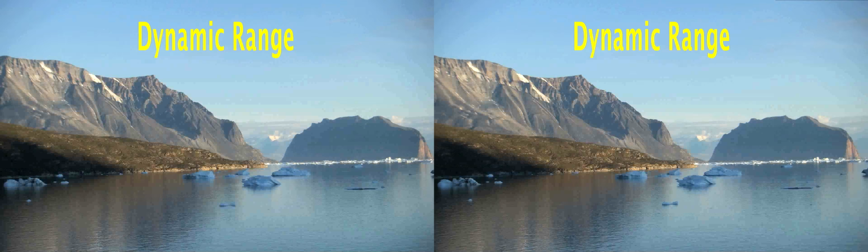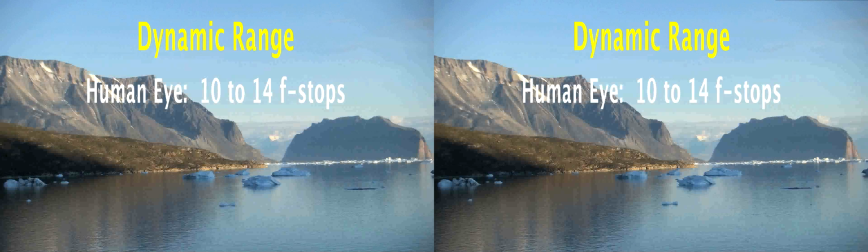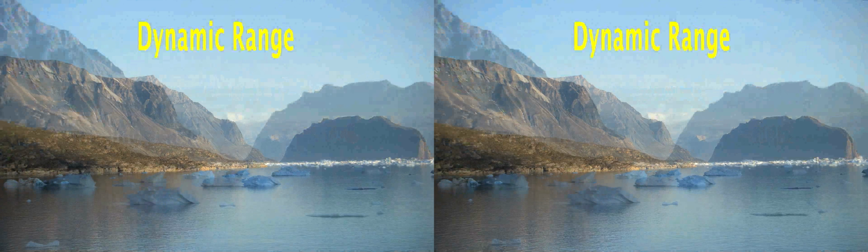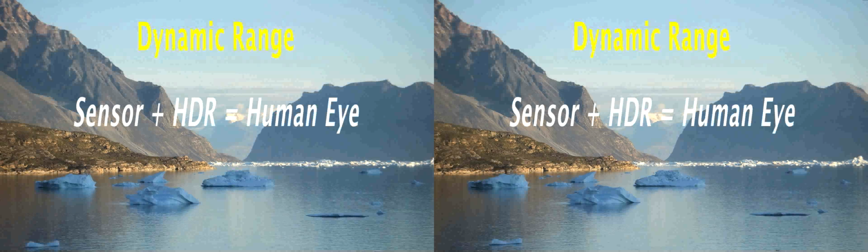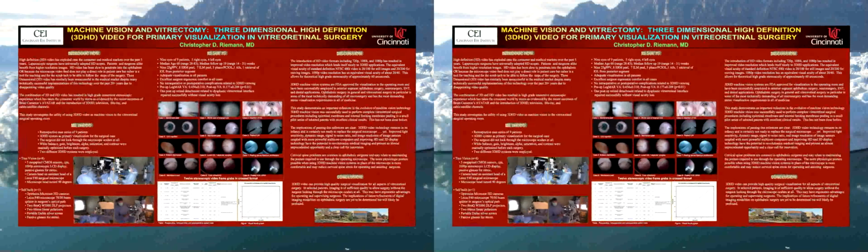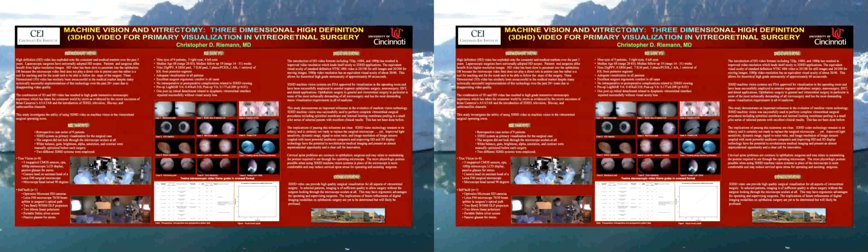The single snapshot dynamic range of the human eye under photopic conditions is in the 10 to 14 f-stop range, which is remarkably close to the 8 to 11 f-stop dynamic range of today's imaging sensors. When these sensors are combined with high dynamic range imaging algorithms, dynamic range is functionally equivalent to optical viewing through the microscope.